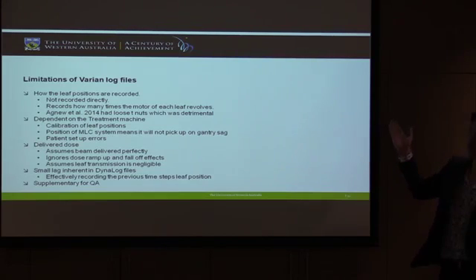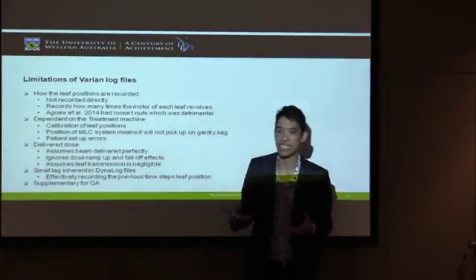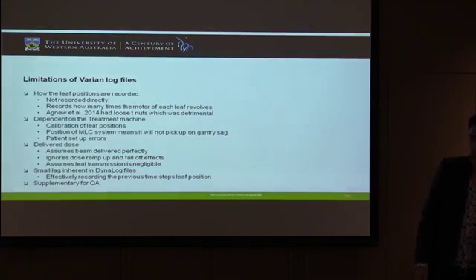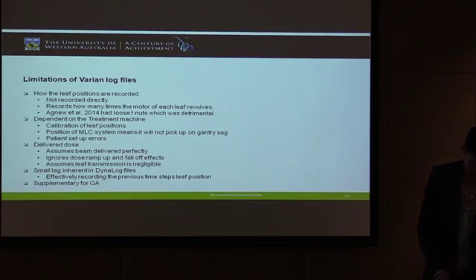But besides all of that, it's great for QA. Not as a primary source by any means. It's right there, it's incredibly easy to pull out, and you can easily run analysis on it computationally. It's really cheap, so you may as well, and it gives you a wealth of data, provided that the data it gives you is correct, is the main thing.